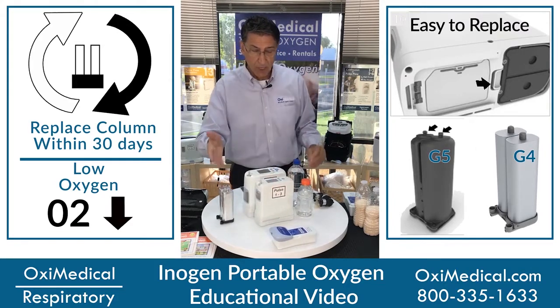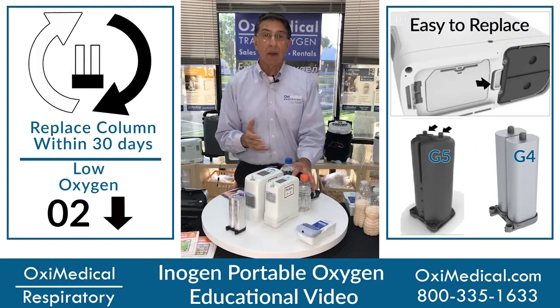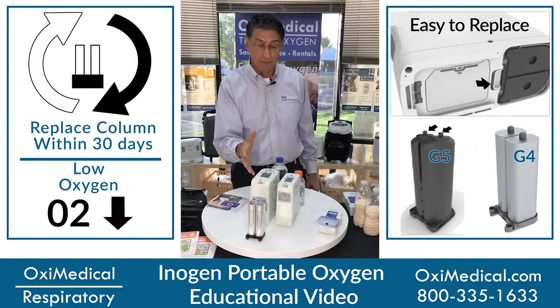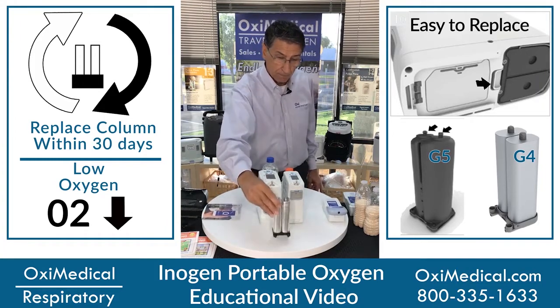They're very inexpensive, but they like to absorb a little bit of moisture and that's where they need to be changed out. And there's going to be a warning sign on the control panel to tell you that it needs service. And there's no rush to change out this canister.